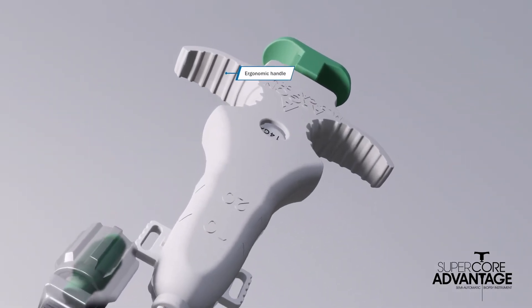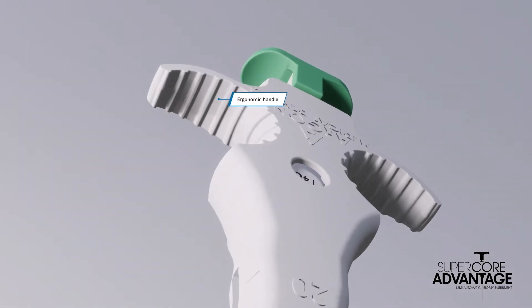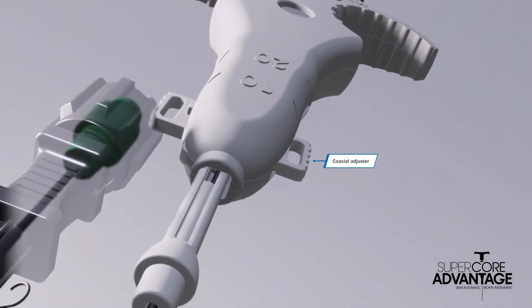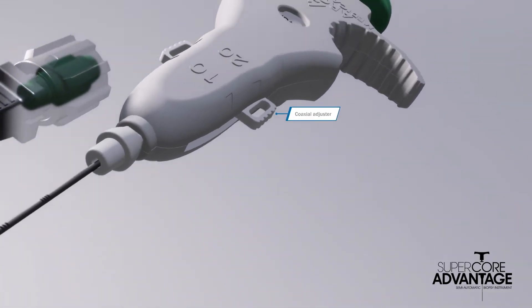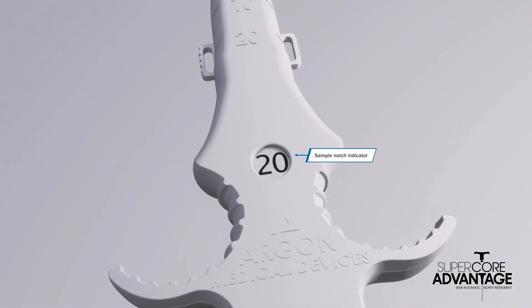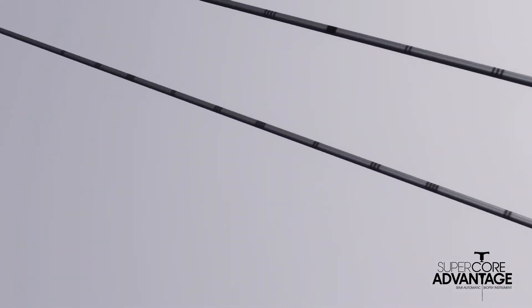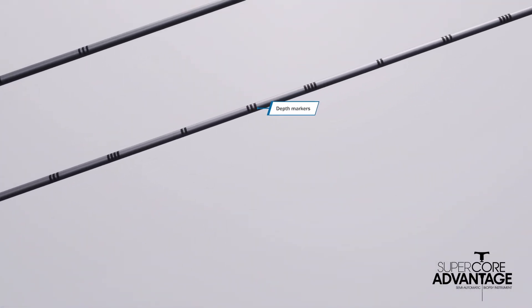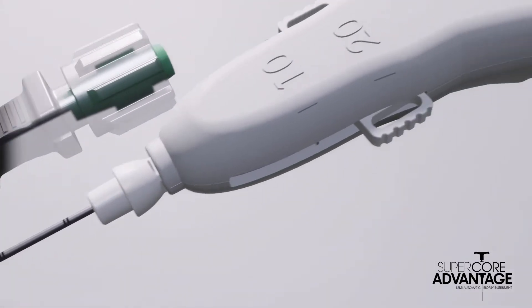Featuring a comfortable ergonomic design, built-in coaxial adjuster, and variable 10mm and 20mm throw lengths, SuperCore Advantage offers optimal clinical flexibility and one of the largest sample notch volumes on the market. Depth markers make it easier to guide the needle to the desired location.